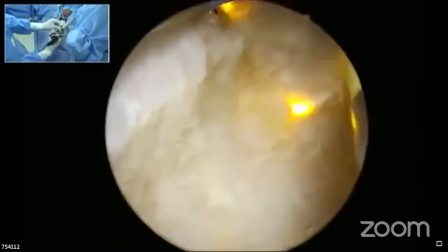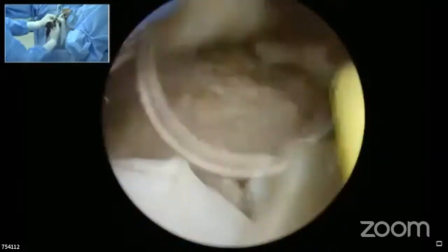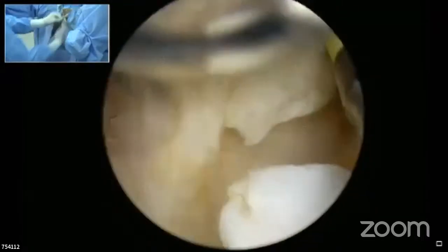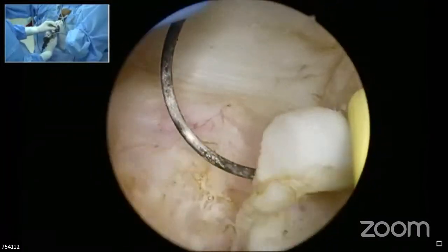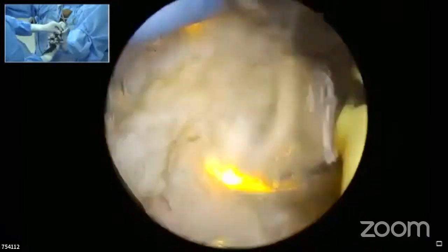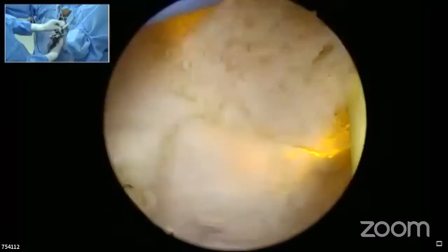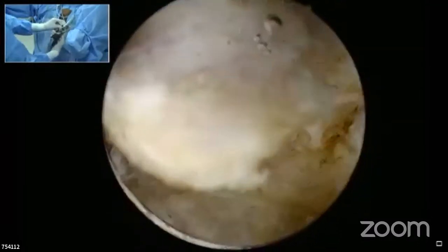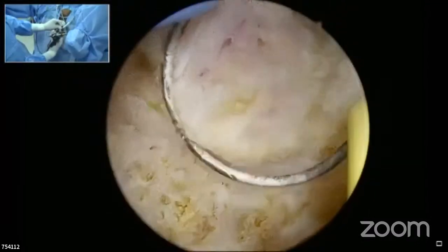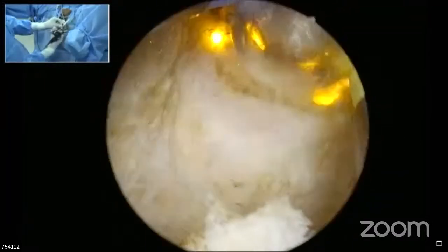Yes, Mallikarjun is there. Yes, sir. He is there, sir. No, the question I want to ask you in your center, I will say, you are doing both that spatula enucleation and now you are showing this technique. Have you compared or tried to see which one is better so that we can come out with some consensus? What should be done, what should not be done? For the young person, it is very confusing for him what to do, what not to do actually.